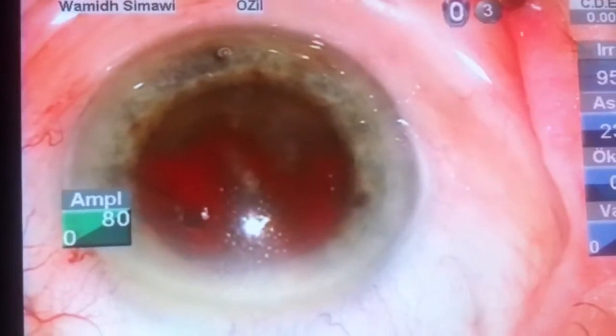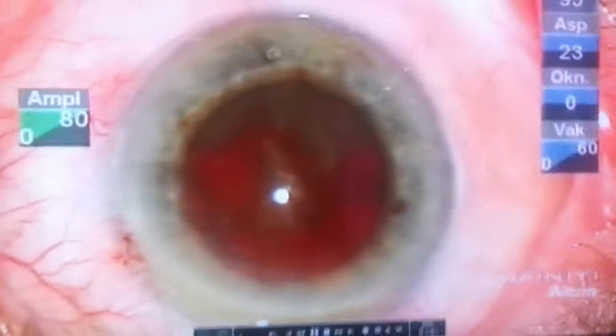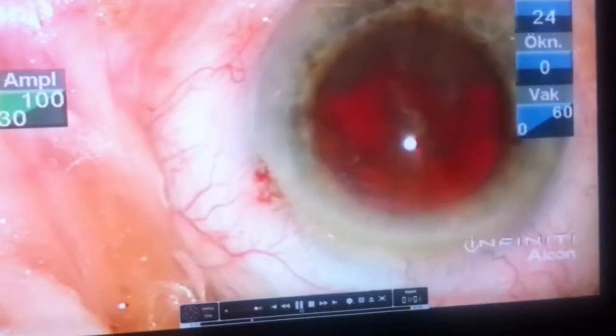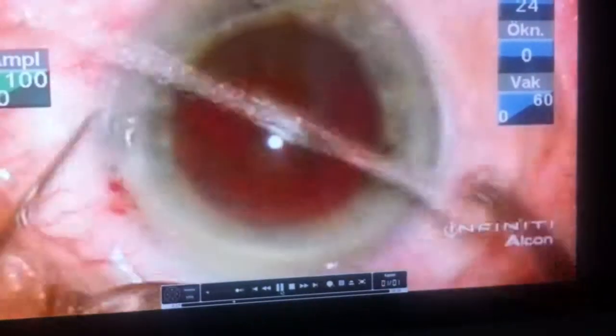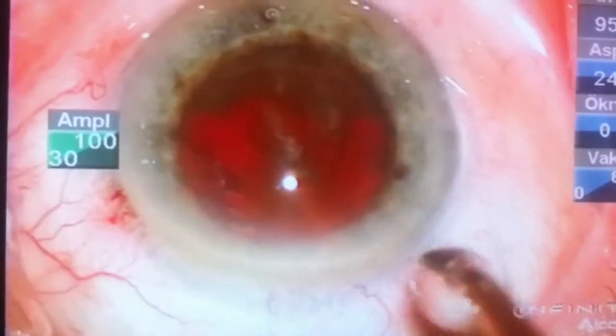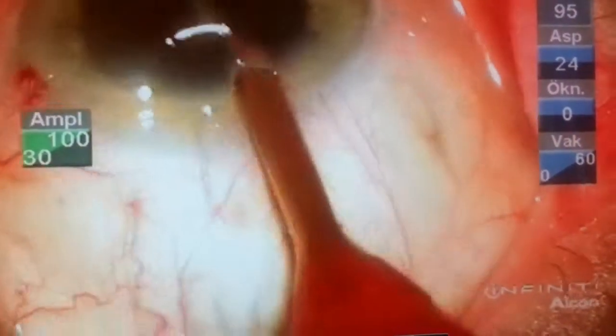This lady is about 91 years old. She has no other pathology in the eye and quite good cooperation. We try to deal with these cases using a combination of vertical and horizontal chop.